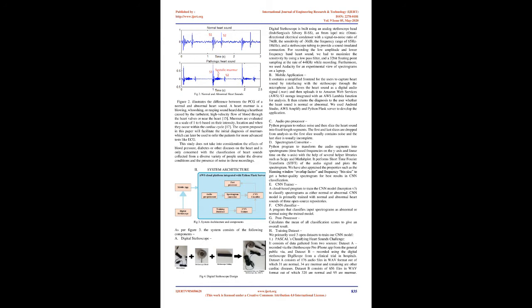System architecture. Fig. 3. System architecture and components. As per Figure 3, the system consists of the following components. A digital stethoscope.